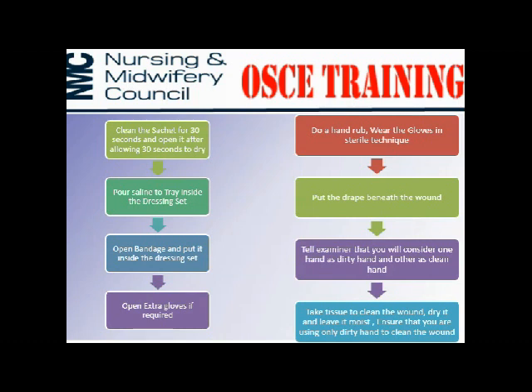Now you need to take the tissue to clean the wound, dry it and leave it moist. Ensure that you are using only the dirty hand to clean the wound. It can be done in such a way that you are taking the tissue with your clean hand, soaking it, squeezing it, wiping on the wound, and then passing it to the dirty hand.